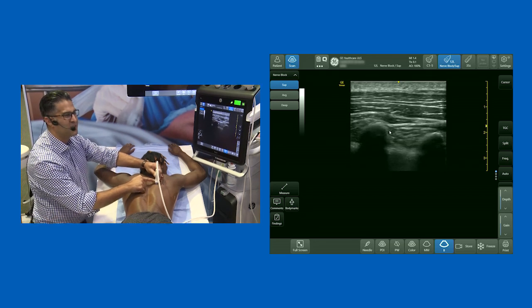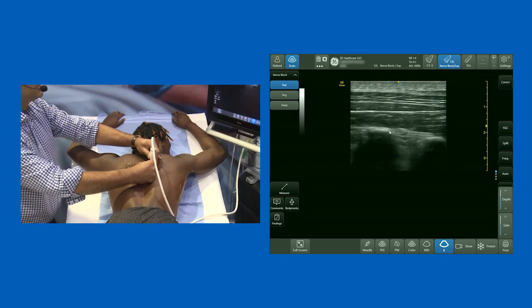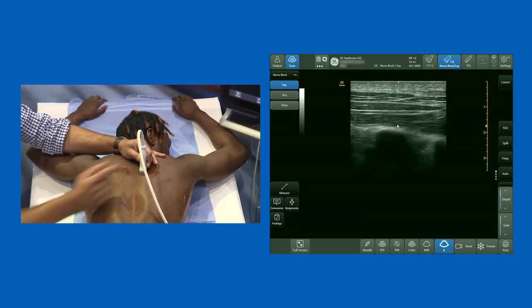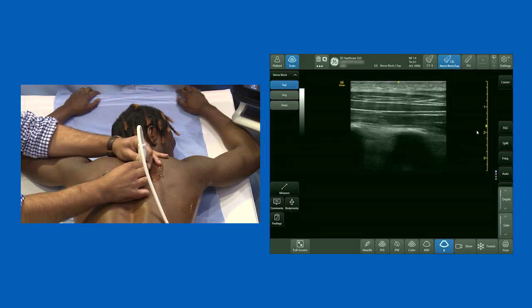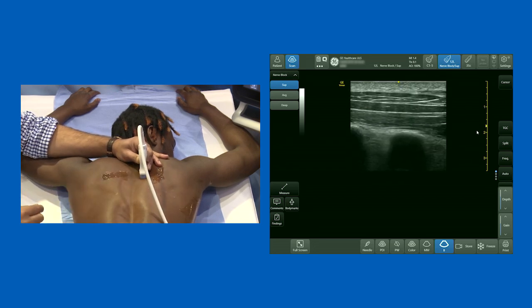Going lateral and then coming back towards the midline — there you can see a really lovely view: small adipose tissue, trapezius, rhomboid, and a beautiful erector spinae complex. What's really important to notice is that when you're lateral, the erector spinae is not that big. You need to be towards the midline over the transverse process to get that view.